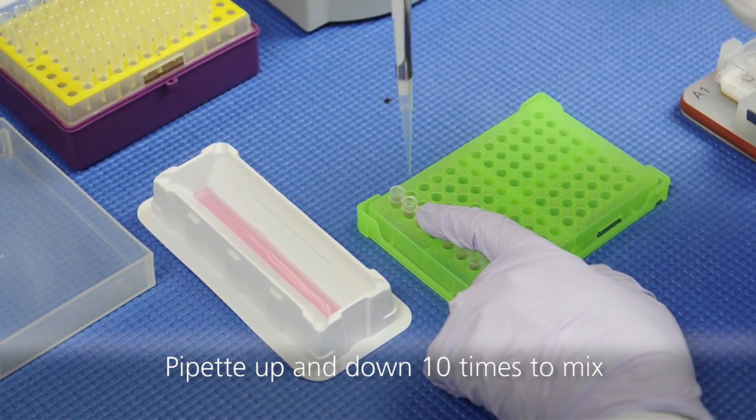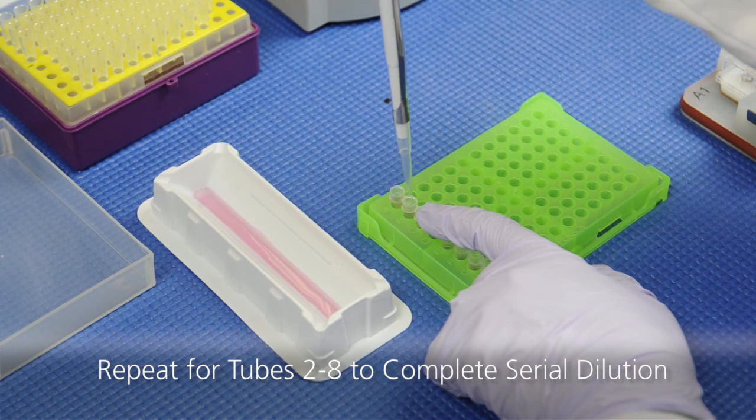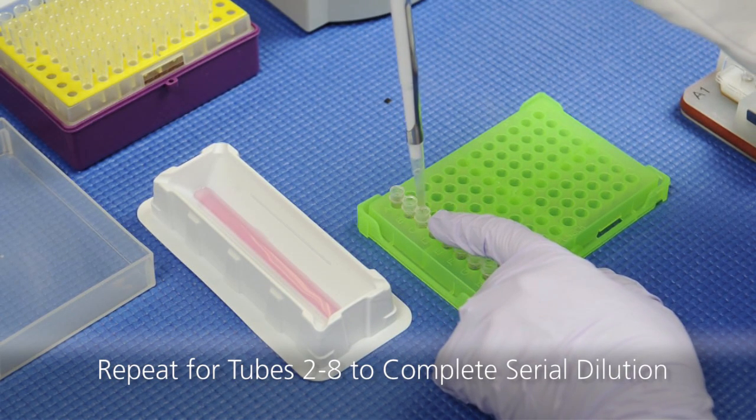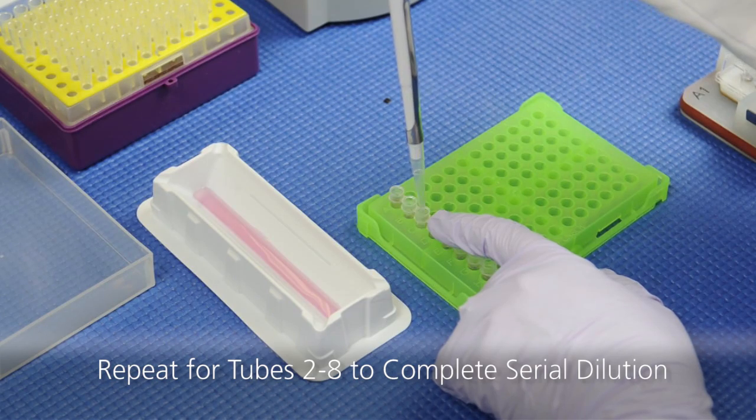Using a new pipet, transfer 50 microliters from tube 2 to tube 3 and repeat for the rest of the tubes.